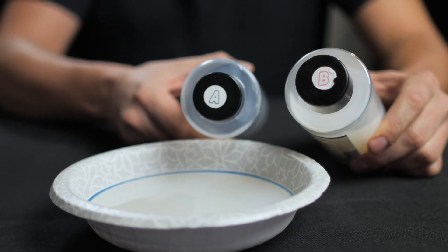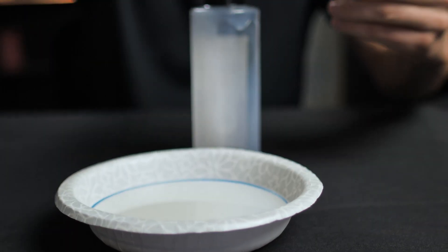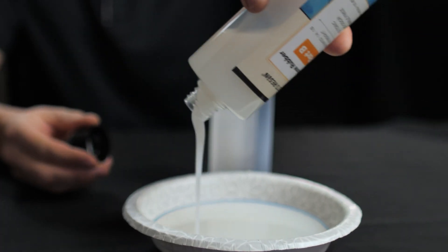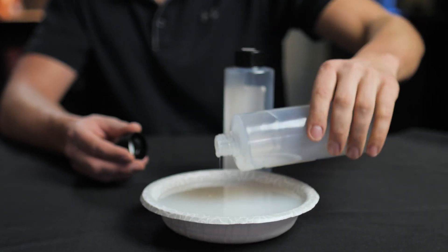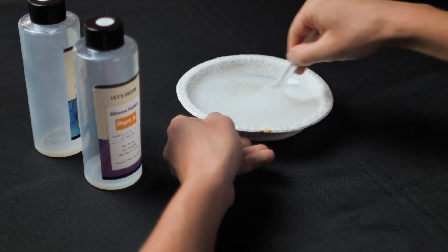So let's go ahead and mix this silicone up and we will pour it in and make our wound packing prop. We have a two-part silicone — Part A and Part B. We're going to pour each one into our bowl. We want equal parts of both Part A and Part B. We're going to mix those together and stir for 5 minutes.